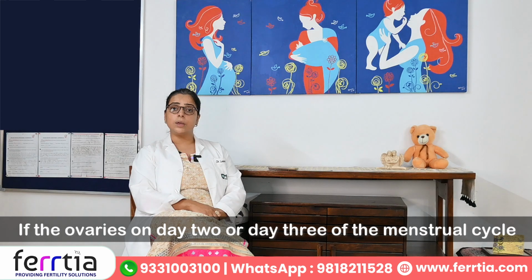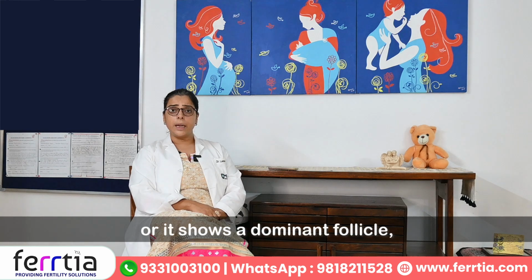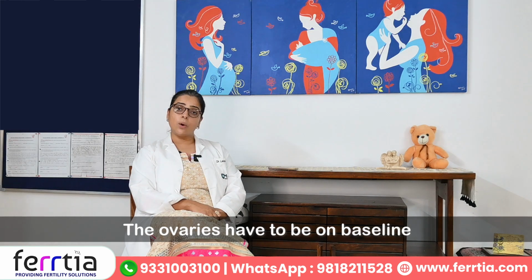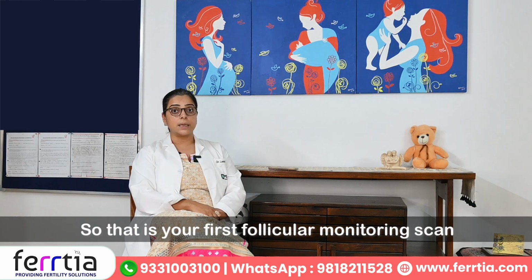If the ovaries on day 2 or day 3 of the menstrual cycle show a cyst or a corpus luteum, or it shows a dominant follicle, a fertility cycle cannot be started. The ovaries have to be on baseline on day 2 or 3 of the menstrual cycle. So that is your first follicular monitoring scan.